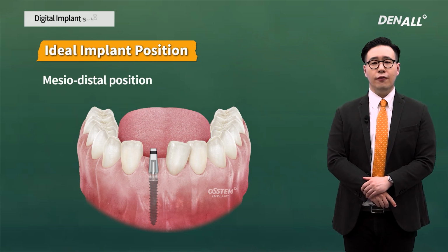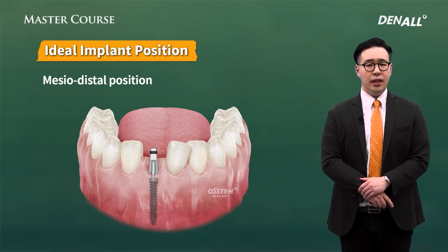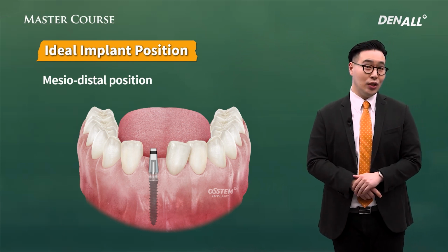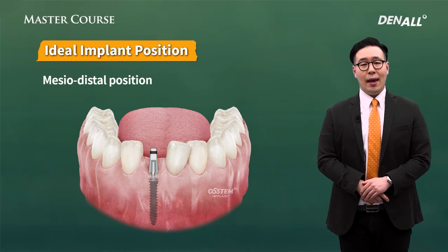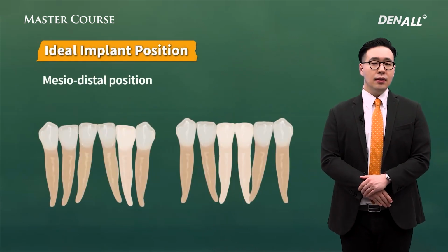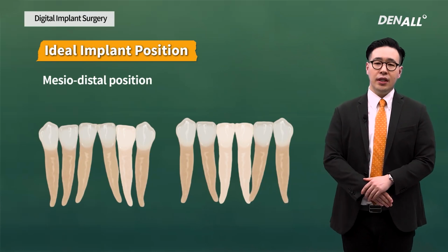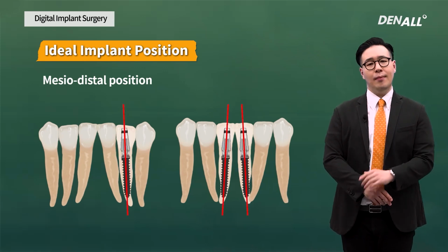At the lower anterior region, flap handling and implant placement should be done very carefully as the submental artery runs in the lingual side of mandible. I use MS implant. For the placement, I mostly use one guide system. As you can see, even when roots are bent or the axis of adjacent teeth is not favorable, I also use this as accurate placement is ensured.